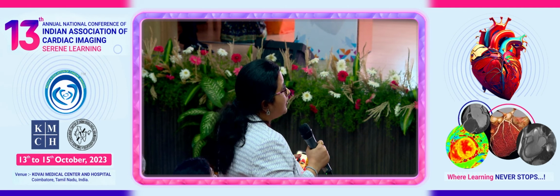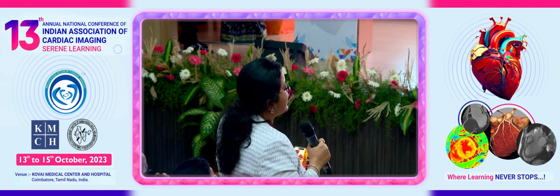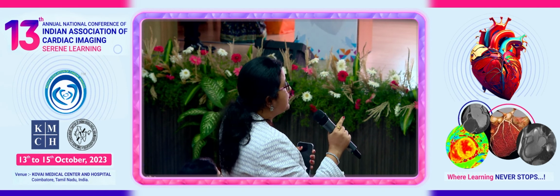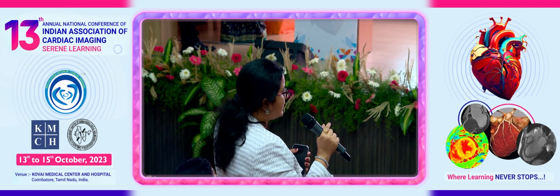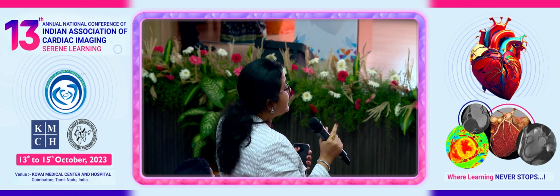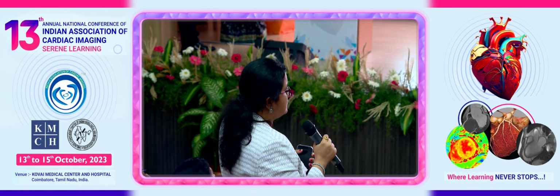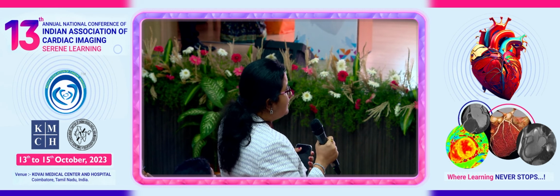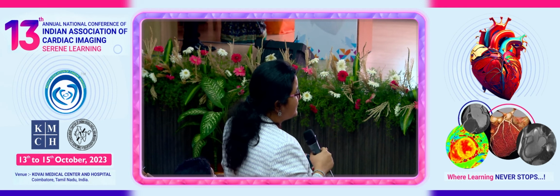It should be body surface area dependent. They proposed 5.2 to 5.6 probably as the upper limit of normal for myocardial wall thickness at the apex, the unindexed equivalent being 11 millimeter. So probably the threshold itself is slightly higher, but of course I haven't read the paper in full. Yeah, good point.